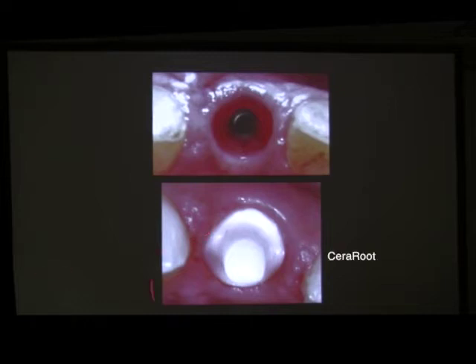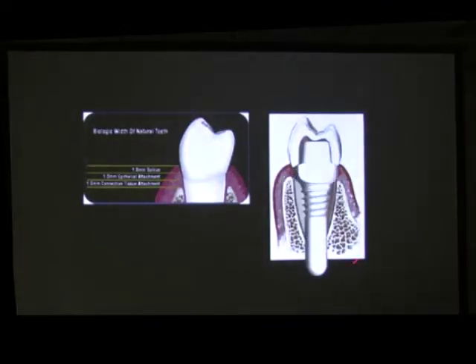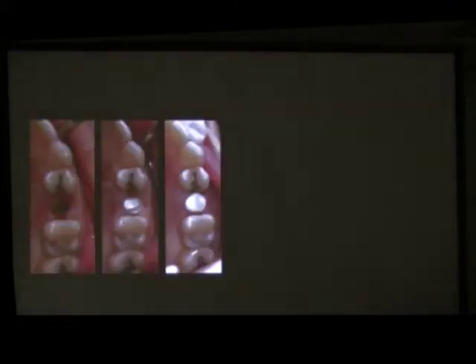So once you bond the crown on this type of implant, patients do not complain, of course, of metal taste, but even more important, they do not feel strong smell coming from their mouth. So this is the type of situation that we always want to see. Sometimes we have the implant deeper because we did a much stronger regeneration, and the implant healed much more nicely than we were hoping or thinking. Sometimes we are deeper than the first millimeter, but try to have all your surgeries as close to the gum line as possible.